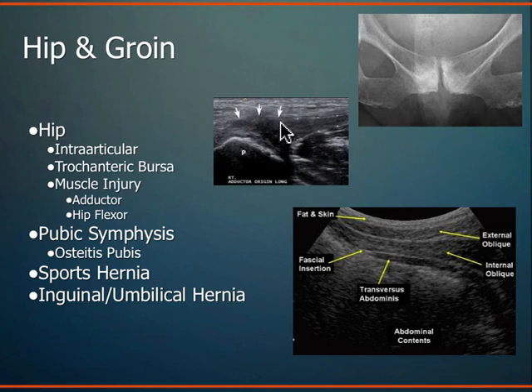The groin and the hip is an area where MRI is traditionally less reliable, and it's very hard to image some of these subtle muscle weaknesses or muscle fascial herniations. And there's things like sports hernia, which is this very nebulous topic where you could have pathology involving either hernia structures or muscle tears or tendon tears, and a lot of different things that can happen in sports hernia that very traditionally is not imaged on MRI, but we see very well with ultrasound. And these are some of the muscle tissues that sometimes can be involved in sports hernia.